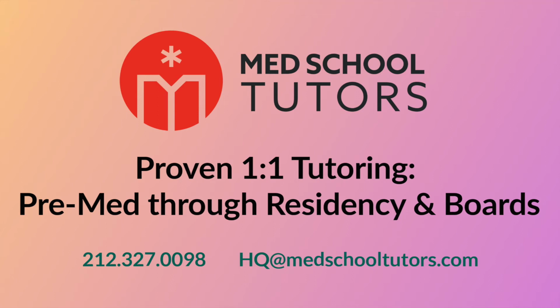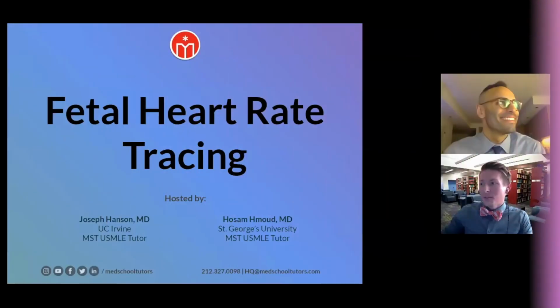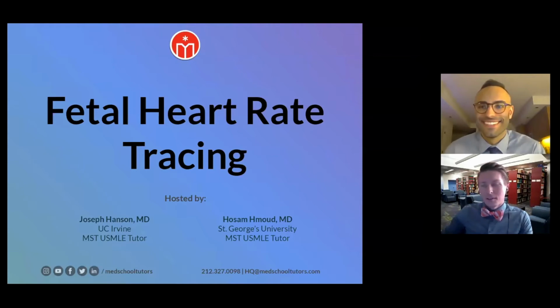Hello, everybody. Thank you for joining us for Med School Tutors Fetal Heart Rate Tracing webinar this evening. Our goal is going to be to teach you guys anything and everything you need to know for the ObGyn shelf and Step 2 CK when it comes to fetal heart rate tracing.